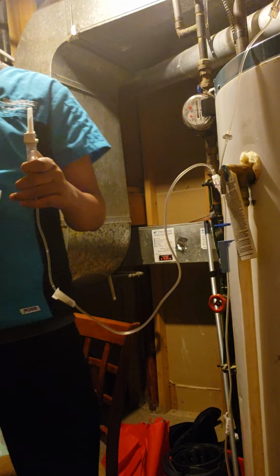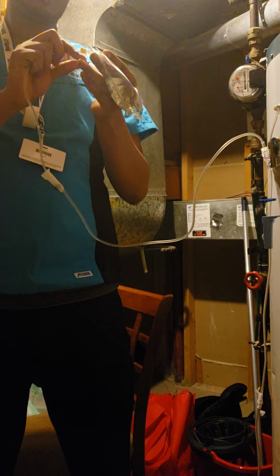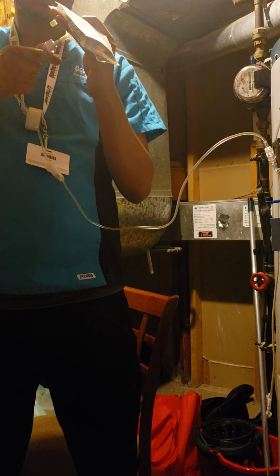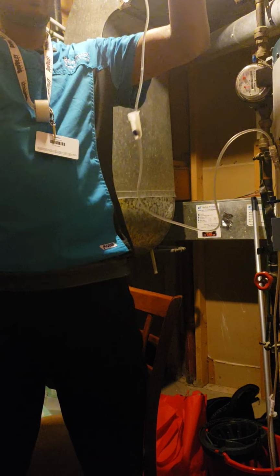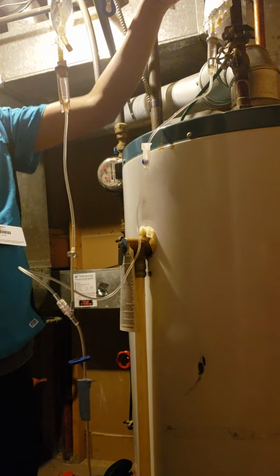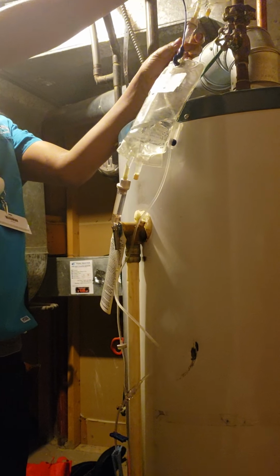Then I have to spike it into my mini bag medication. Remove this one right there. Open it. Spike it very hard. And then it's not flowing because I've closed it. Then I have to pull this one down and put this one up, and then hang this one with this secondary line.